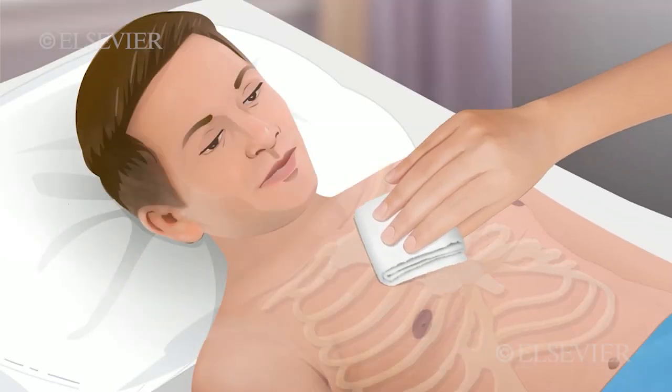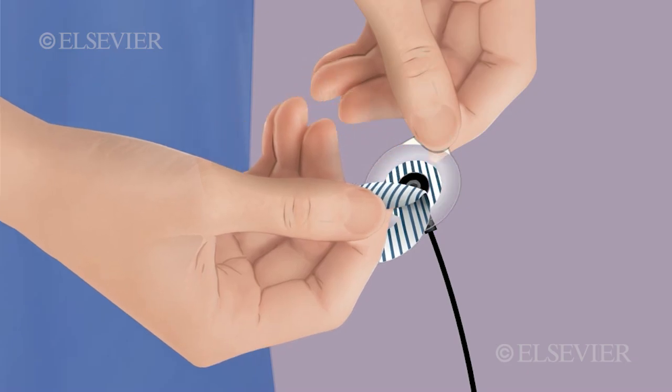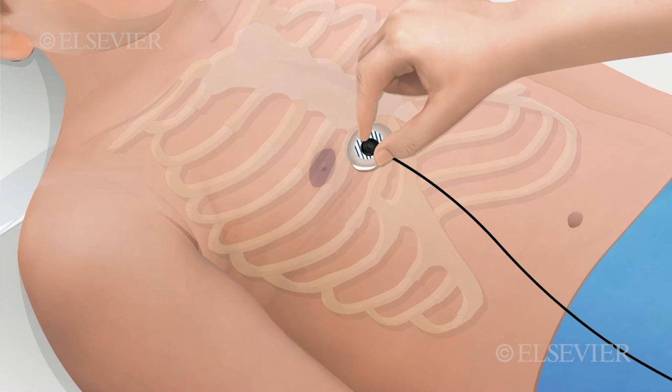Wash the patient's skin with soap and water and dry it briskly with gauze pads or a washcloth. Remove the backing from the pre-gelled electrodes and test the centers of the pads for moistness. Place the electrodes on the patient. Apply electrodes by pressing around their entire edges. Do not press directly on the gel pads.